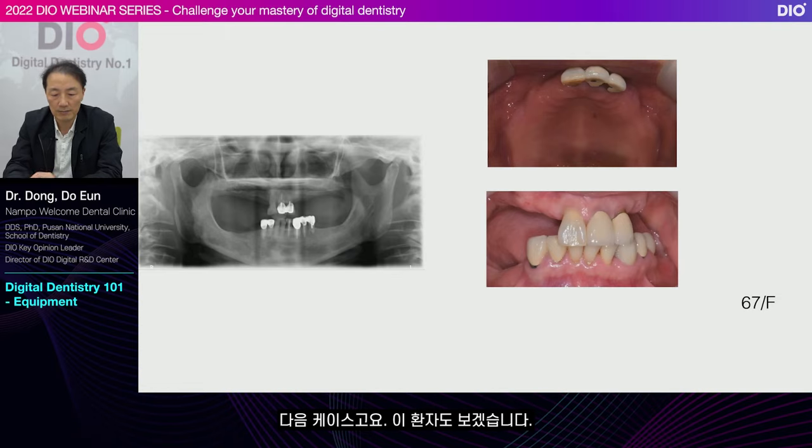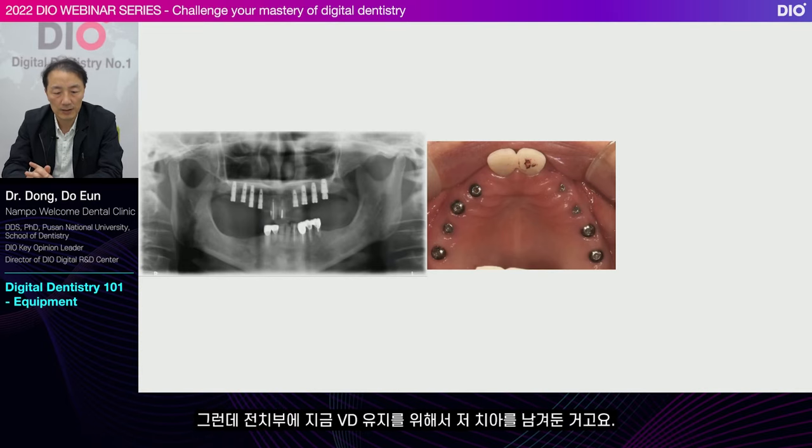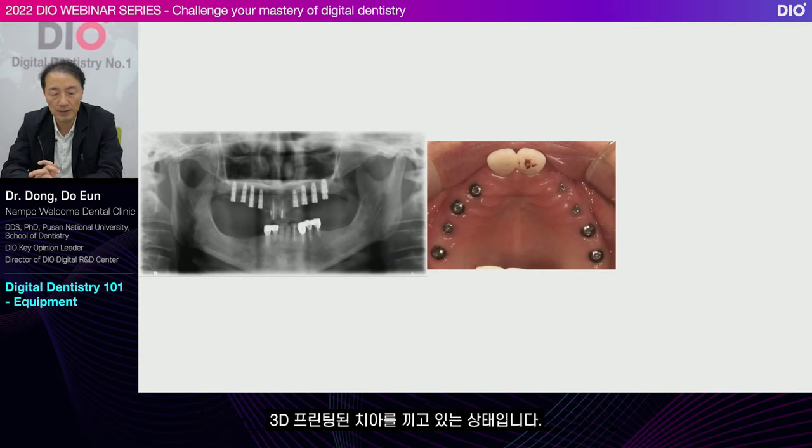This is the next case. Let's look at this patient. Implants were placed in the molar area, but I left that tooth in the anterior part to maintain the VD. This is with the 3D printed tooth.